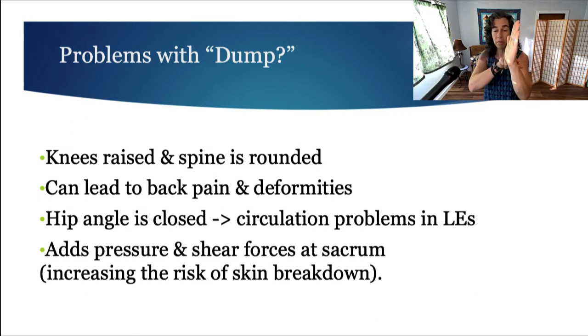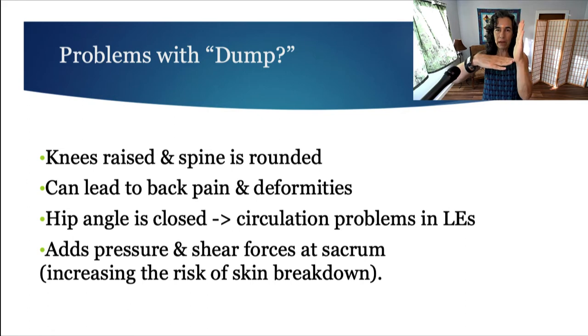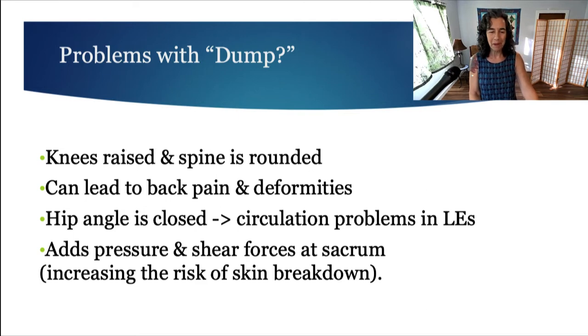So sacrum here, wheelchair seat here, there's downward pressure, but when we add dump or rake, there's downward pressure and inward pressure. Hopefully that makes sense. Let me know if you have questions. I'll be happy to demo and also to talk about it more.